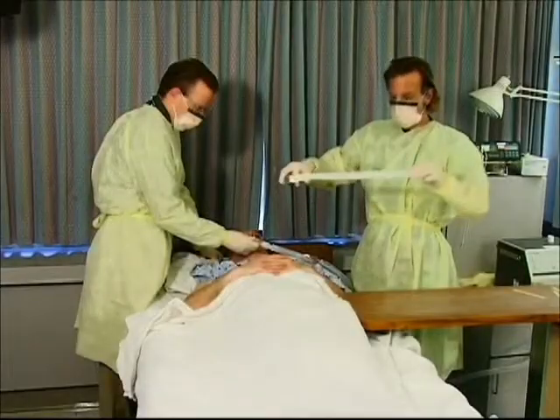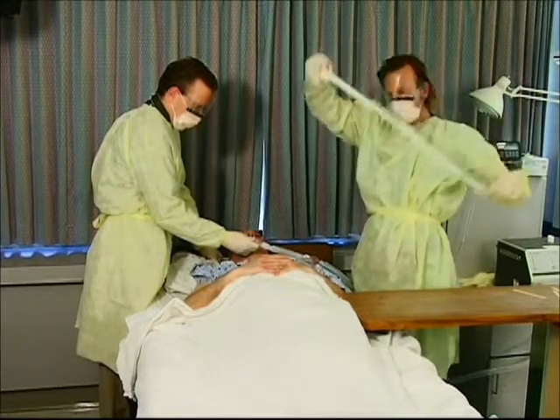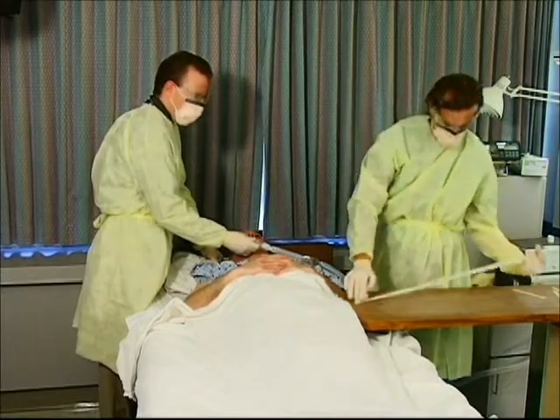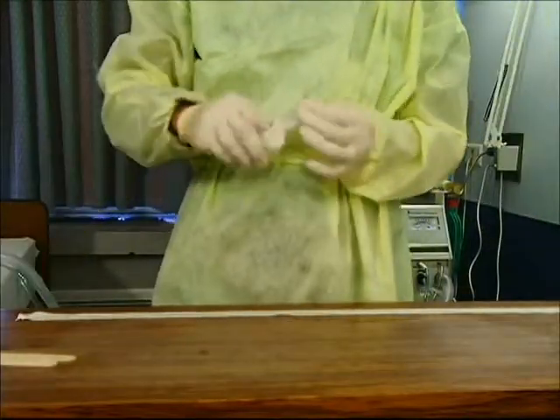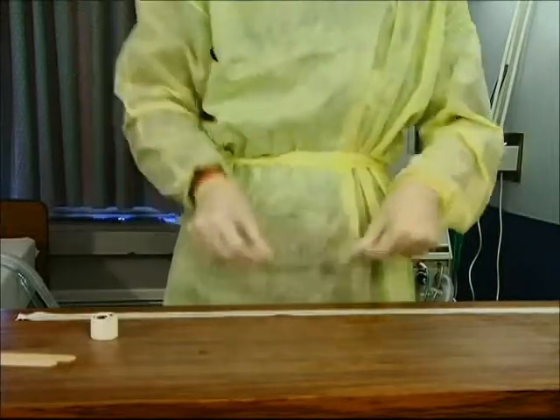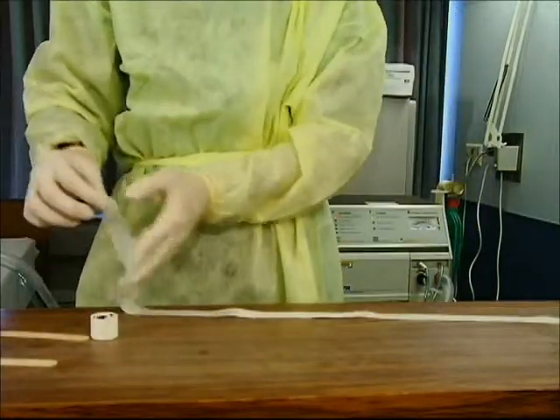Begin preparing the tape by cutting a length of one-inch cloth tape by using your neck as demonstrated. The tape will need to be long enough to go behind the patient's neck and cross over in front of the patient's face — approximately two feet of tape is required. Tear the tape and lay the two-foot section flat, sticky side up. Tear a smaller piece of tape, approximately four inches in length, and place sticky side down in the center of the longer piece. This non-sticky center prevents the tape from adhering to the back of the patient's head.